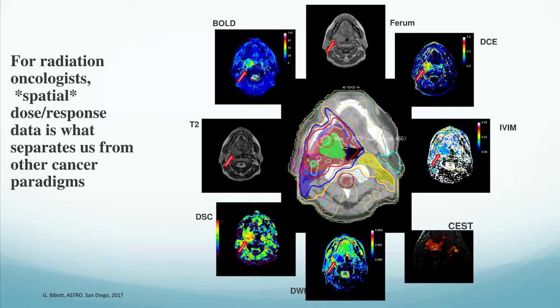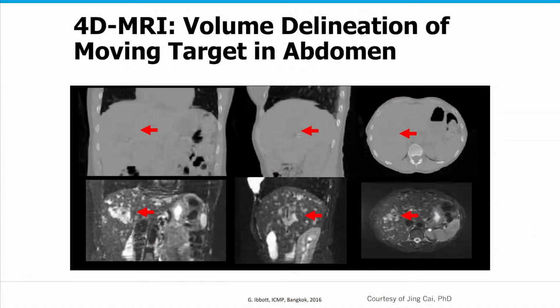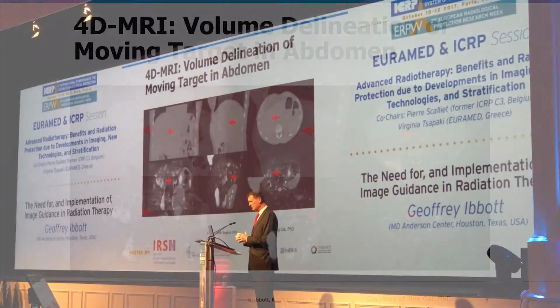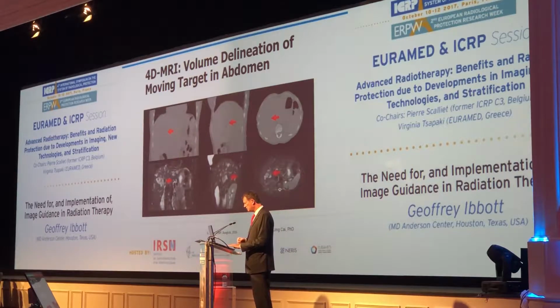And access to these imaging technologies, these pulse sequences for MR, really separate radiation oncologists from other cancer specialists, because this shows us where the tumor is and how to get to it. I mentioned motion a few minutes ago, and again, we can perform 4D CT scanning and demonstrate motion, but in the abdomen, we can't see anything other than the diaphragm moving, whereas in the lower images of an MR scan taken in a 4D mode, we can clearly see the motion of the tumor, our target volume, so we have the potential of tracking it.